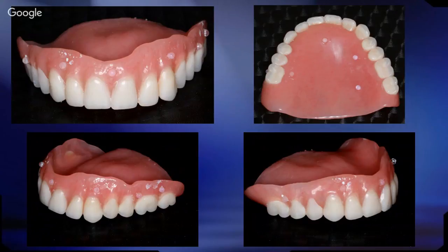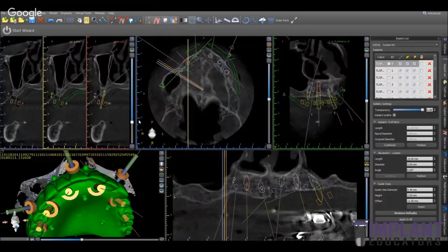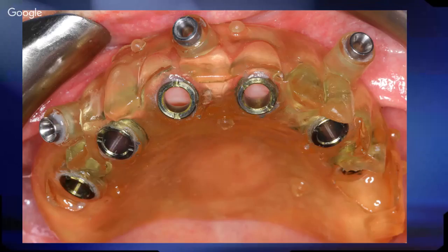Now, in this situation, we're not concerned about X-ray scatter because there's no metal in the patient's jaw in this particular case, because they're fully edentulous. So we bring in both data sets and merge them like we showed before, using the 4 screens and picking the points, matching up the glass beads. Planning implants, and in this case, you can see the 2 distal implants are going to be planned at an angle. And the implants, especially on the right-hand side, are going to be quite deep in the bone. You'll see in a minute how they ended up.